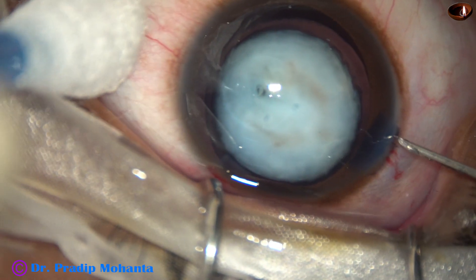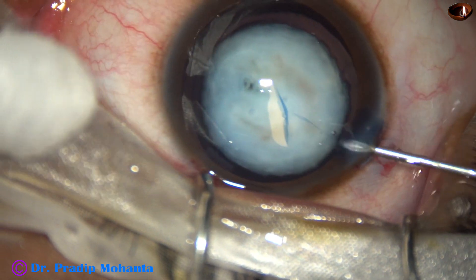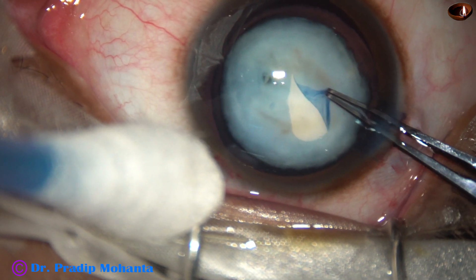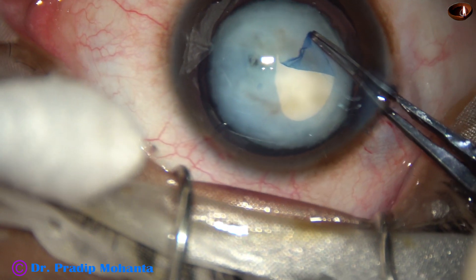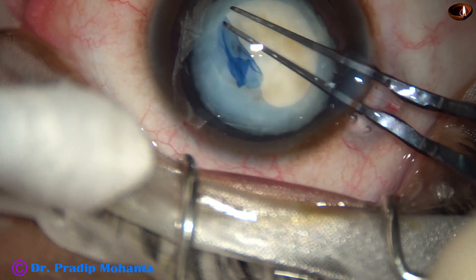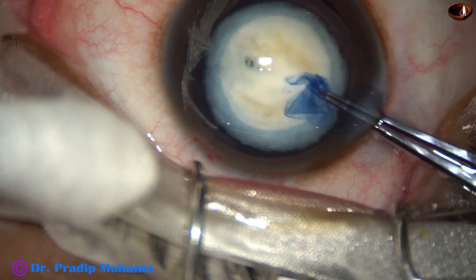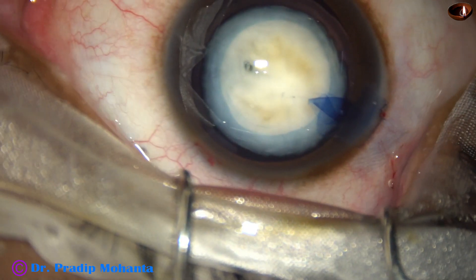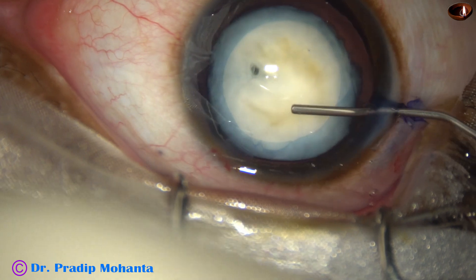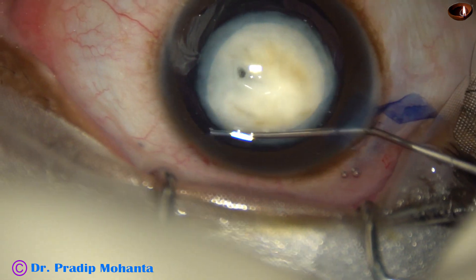Viscoelastic is applied to fill up the anterior chamber. And now a big incision on the anterior capsule with a sharp needle. Now I take the capsulorhexis forceps, hold this capsular tag, and do a rhexis of about 5 mm, going all around. Young patient, so the zonule is okay. Now hydrodissection is done at two or three places.